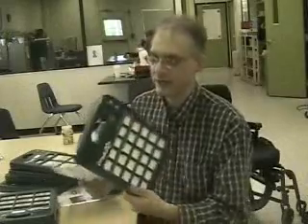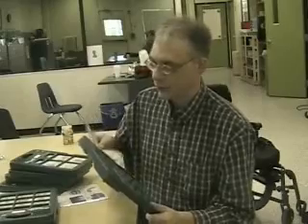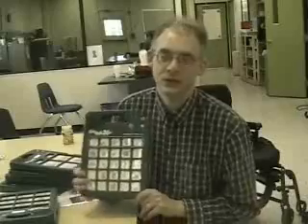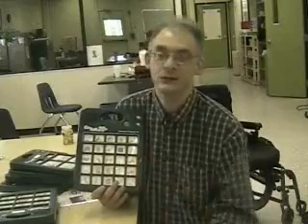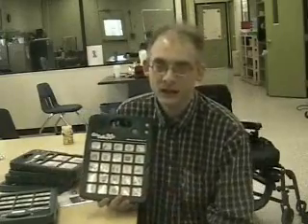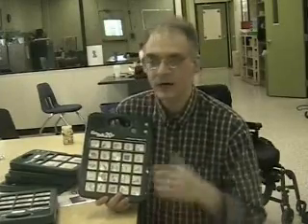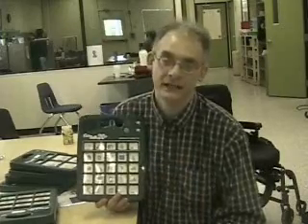Even though these are created by Attainment Company, they kind of work together, and the Boardmaker software runs about $300. So if you individually as a parent would want to get one of these, the whole outfit with the Boardmaker software and this would be about $600. But Boardmaker will service all of these GoTalks plus other augmentative communication devices. It can also be used for a lot of different things besides communication devices.